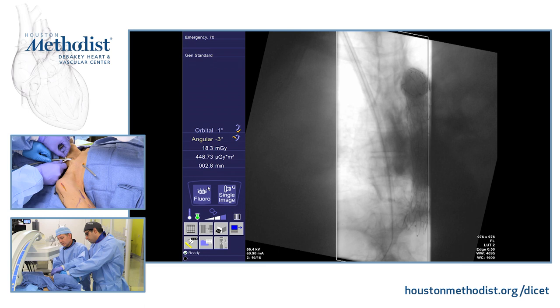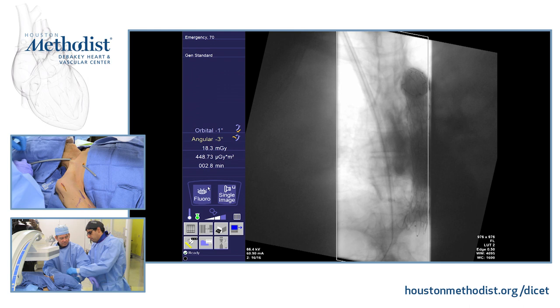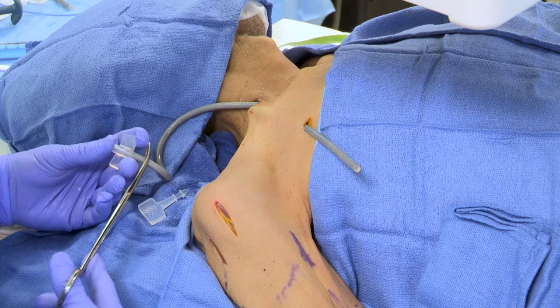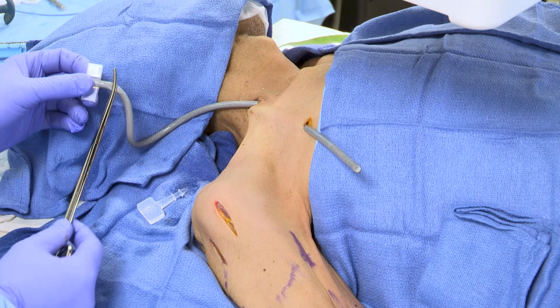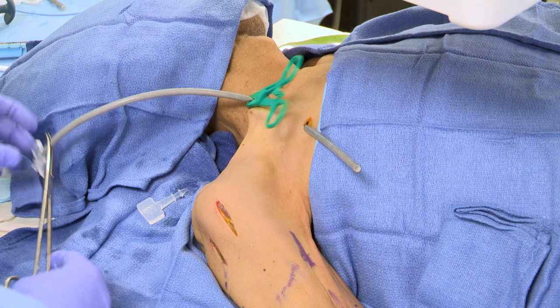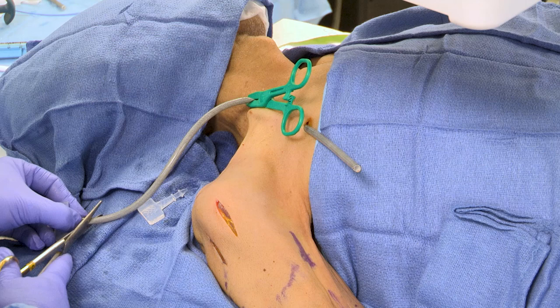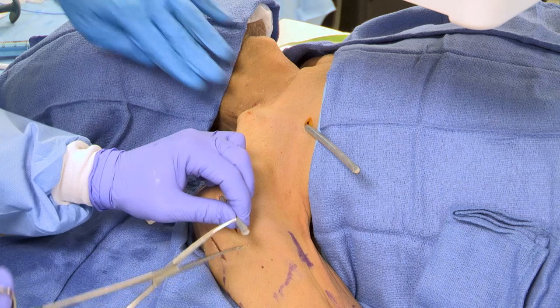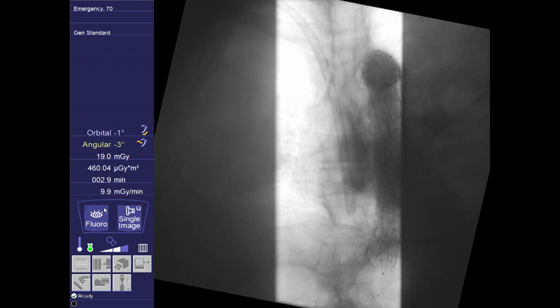Confirm the position again. At this point we can remove the stylet and the wire. Note that a large metal clamp can only be used on portions of the catheter you plan to discard — if you plan to use that portion you should use the approved soft catheter clamp that comes with the device. We can cut this at an angle for tunneling. Again this is a discard portion so we'll clamp that. It's very important to check that the distal endpoint is in the proper position — we'd like that right in the right mid-atrium.